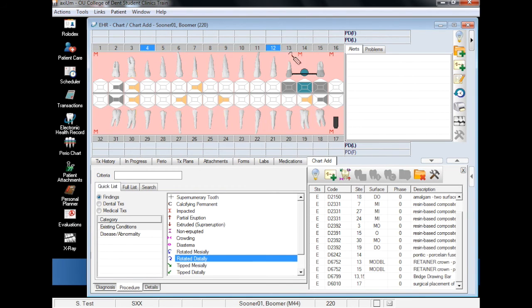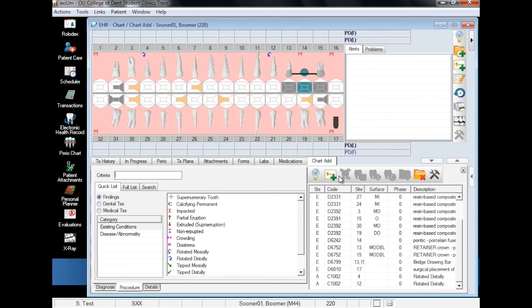and finally, add finding. Note that both teeth now have blue winding arrow next to them indicating distal rotation.